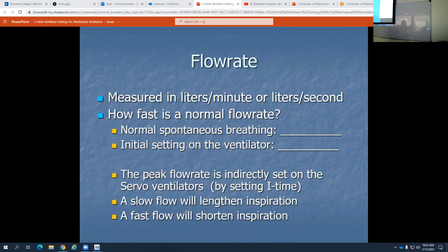So is that when we're looking at the graphs, sometimes there is a patient triggered breath because they can breathe, just not well enough on their own? Yes, very good. They could be breathing really fast on their own and still not be put on the ventilator. Yeah, they wear out after a while. Their muscles become fatigued and they can't keep up with that high demand. So when they get fatigued, then the ventilator is there to back up what they're doing.